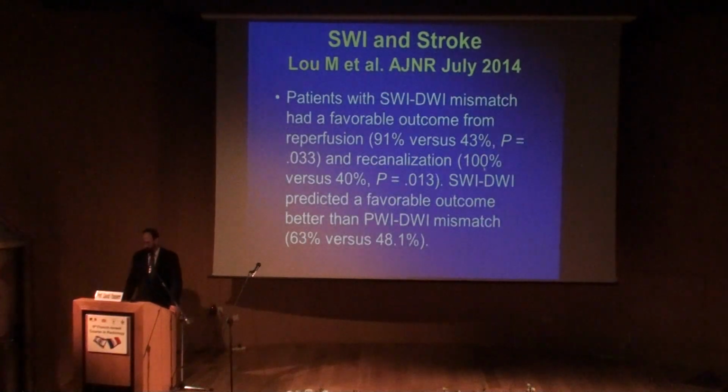This is another article from July 2014 saying that when you have a mismatch and you reperfuse it, you have a very good outcome. So it is a prognostic factor for intervention with reperfusion, both with IV-tPA as well as intra-arterial therapy.